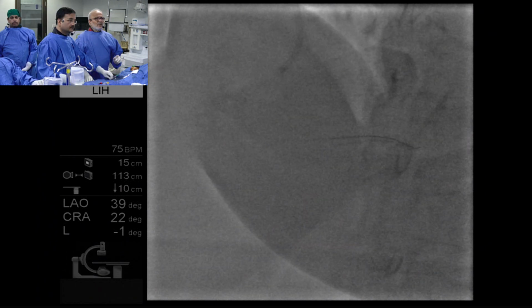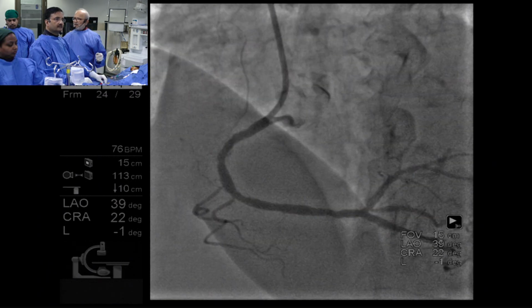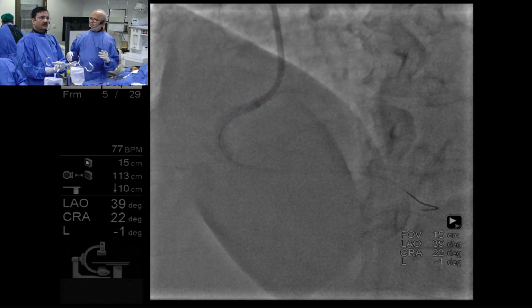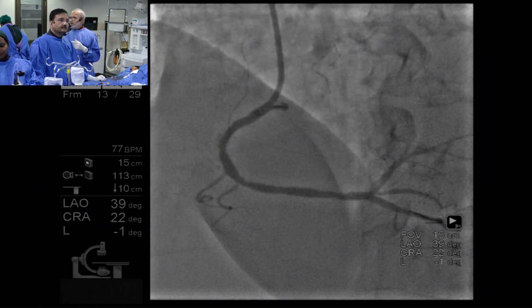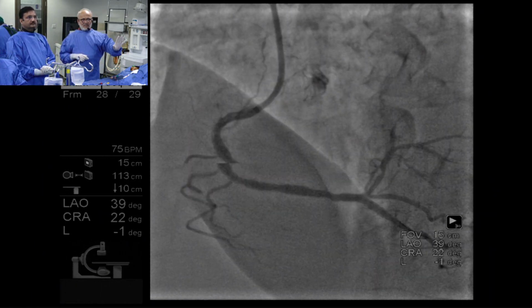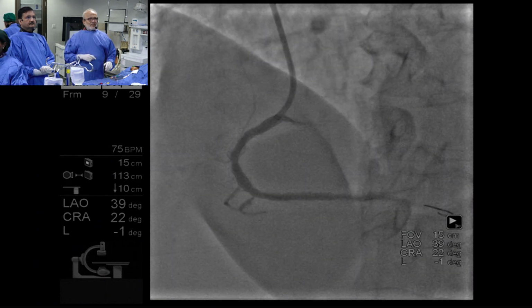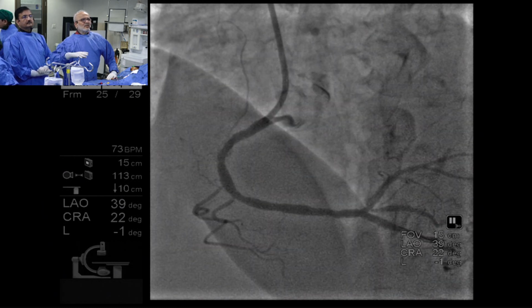And now proximal also we decided to take a 3 millimeter stent, right? 3 by 15. Yes. Get me Xience Alpine. Here if I find a lot of malapposition in the little longer segment distally, then I will expand it with maybe a short 4 millimeter balloon, not otherwise, which probably 99% will not be required. You think this would be a little longer than 15, Tejas? 15 is perfect, Khaled.